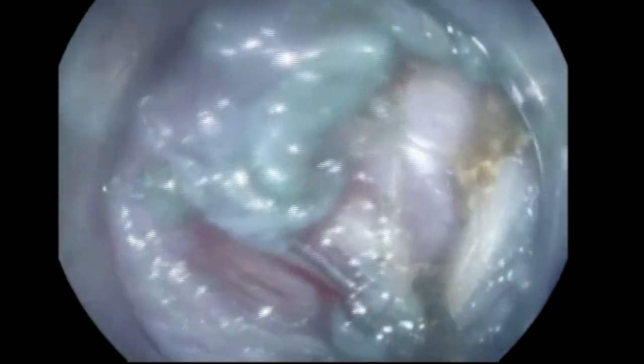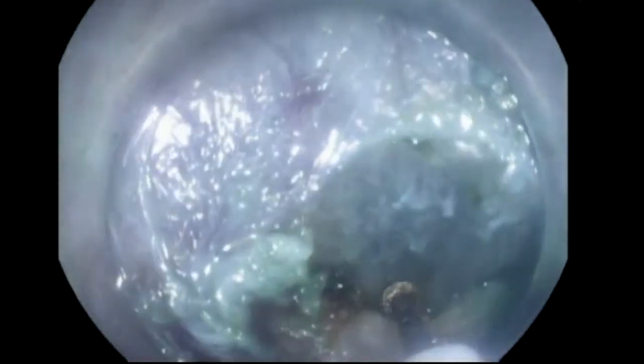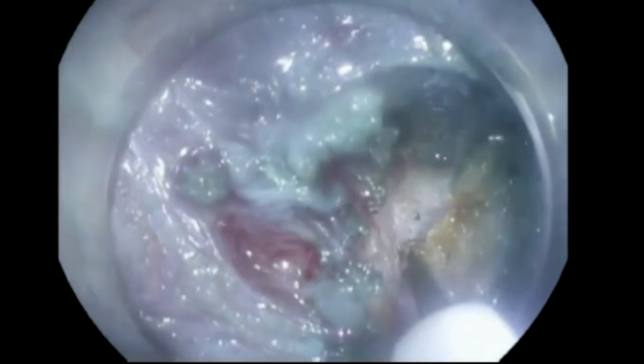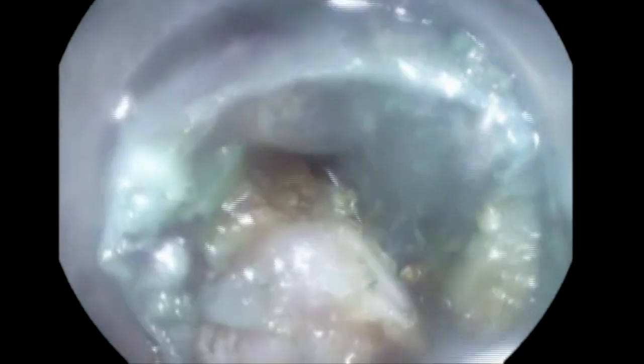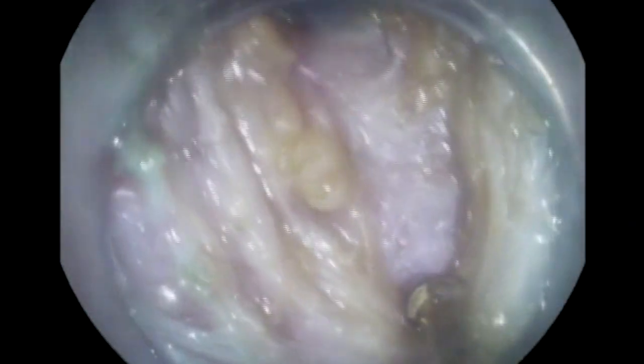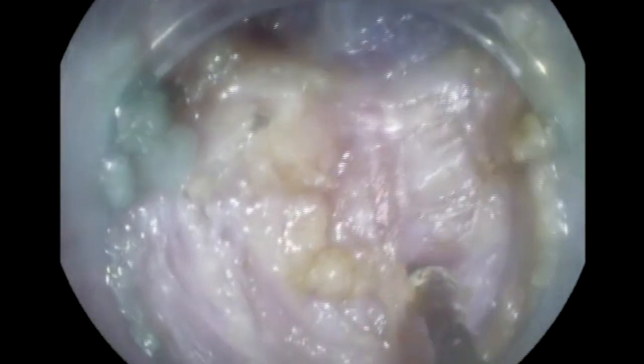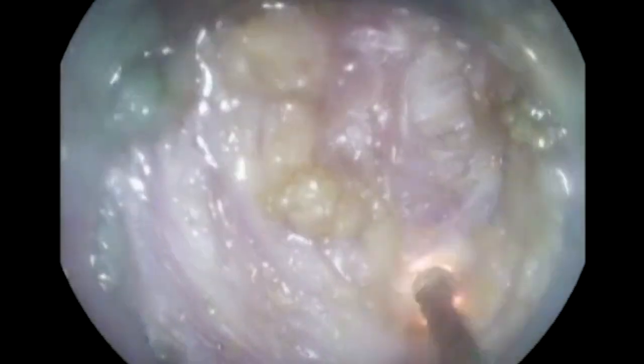Once we confirm that, we'll start the pyloromyotomy part. Now we're cutting the muscle of the pylorus. The pyloric muscle is a very thick muscle and you will need to dissect carefully and gradually, layer after layer. You have to be careful not to dissect the duodenal mucosa. As much as I can, I'm dissecting the muscle staying away from the duodenal mucosa. Spend as much time as you need — carefully dissect, little by little. If you do big moves here, you may end up with either a duodenal injury or a large retroperitoneal perforation.